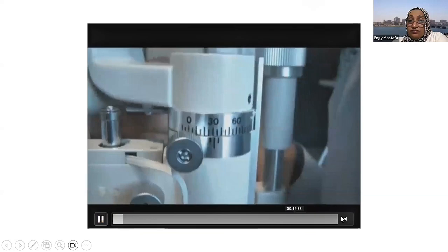Sometimes, even if you start by looking at the eye and seeing a patient that is a little bit photophobic with a regular epithelium, you have to ask why he is that photophobic.